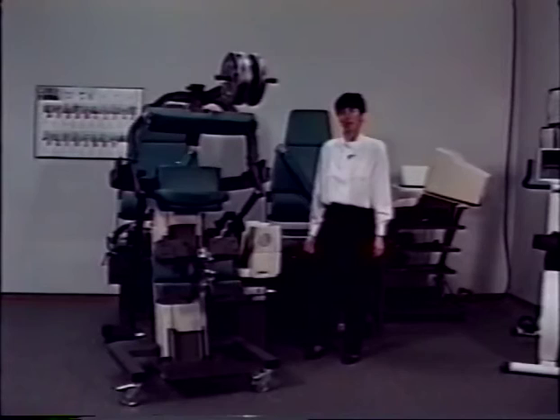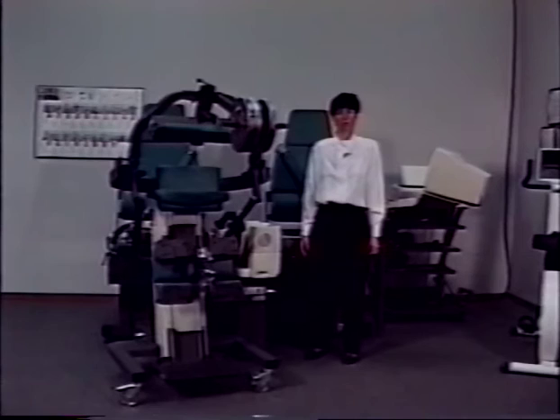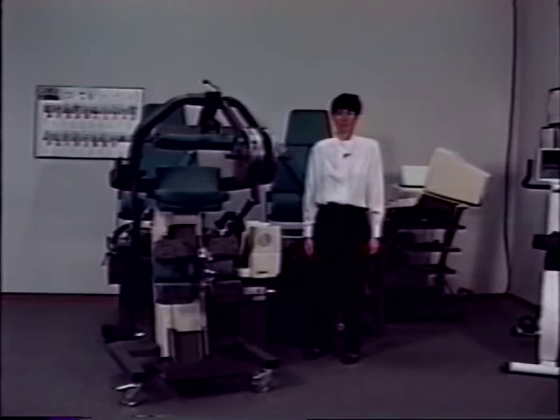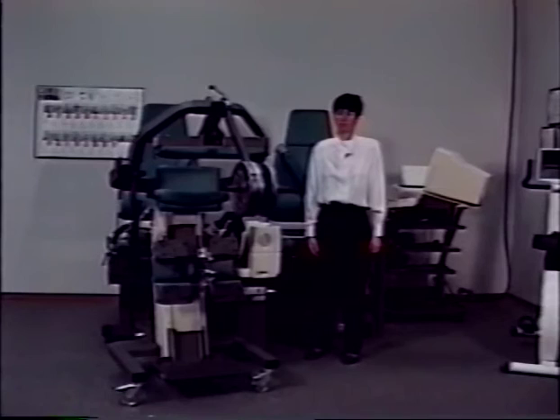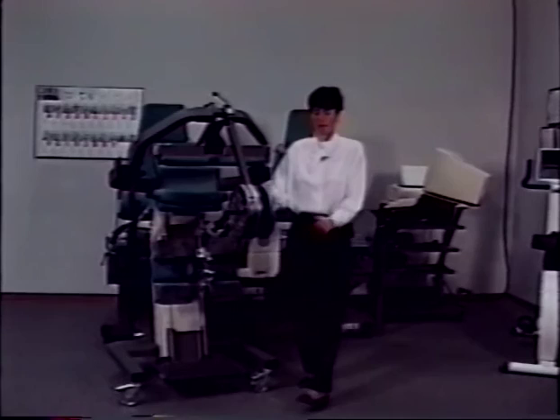Stay clear of the TEF modular component while it drops the input arm with the 75 pounds of weight. When the unit tones, your calibration is complete. Upon hearing the tone, remove the weights and the calibration T-bar. Consult your user's guide for a complete written description.